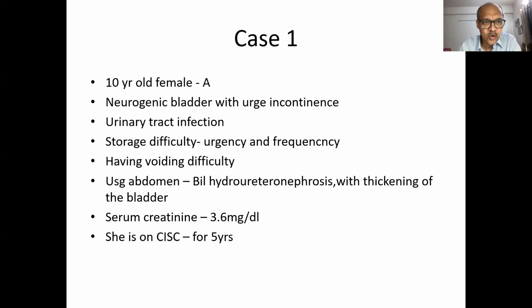Okay, we'll just take a look for a brief moment, because ultimately the clinical context is more important than the tracings. In any patient with neurogenic dysfunction, if you're getting recurrent urinary tract infection, that's a red flag for a lower urinary tract which is not managed perfectly. So you expect, let's say, 1 episode of infection in a year in somebody on CIC; that much is okay.